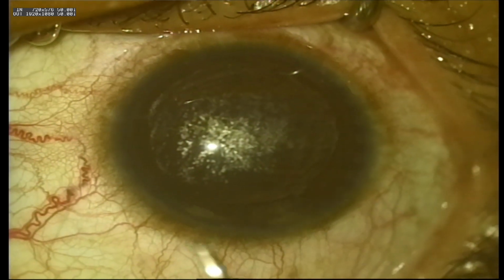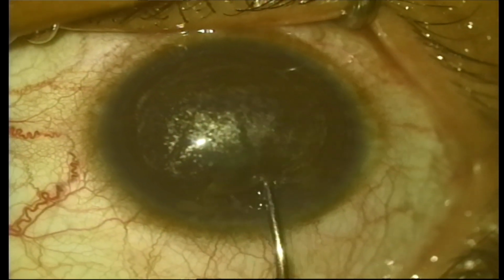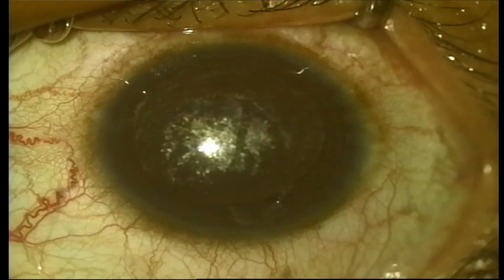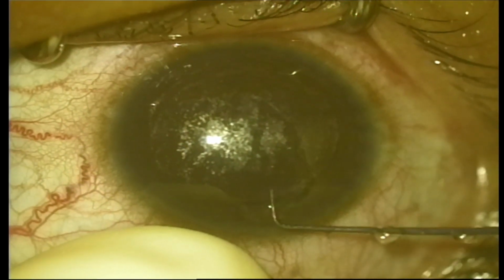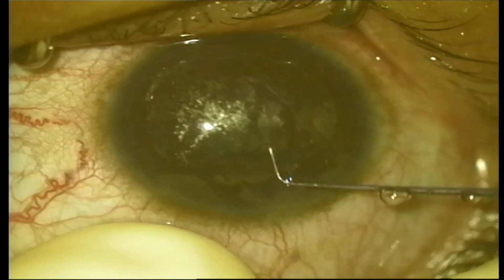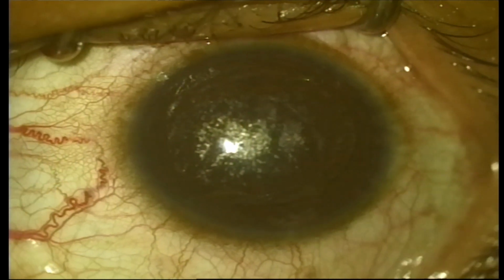When you go into the posterior of the lenticule, give me that first one. When you go into the posterior of the lenticule, you should not disengage totally from one side because you get a taco effect. So this is the posterior of the lenticule that I have again separated. Put one drop.